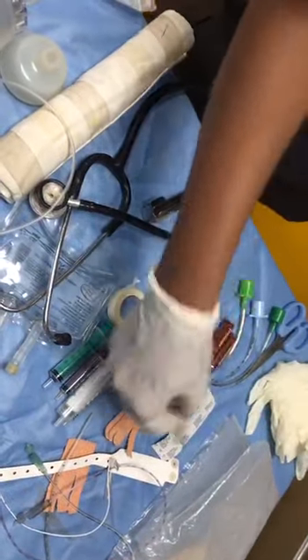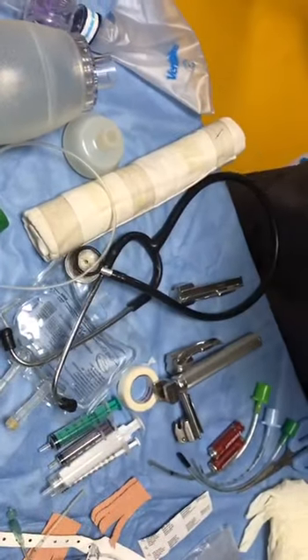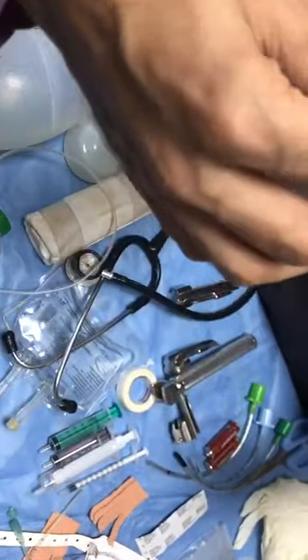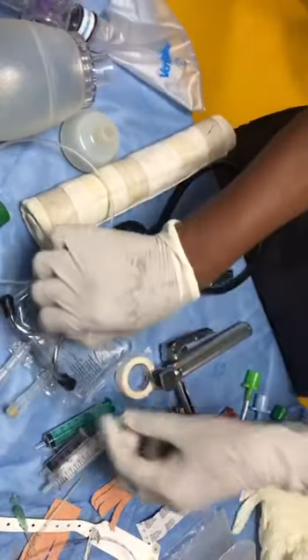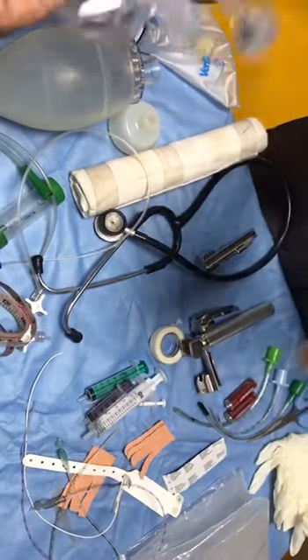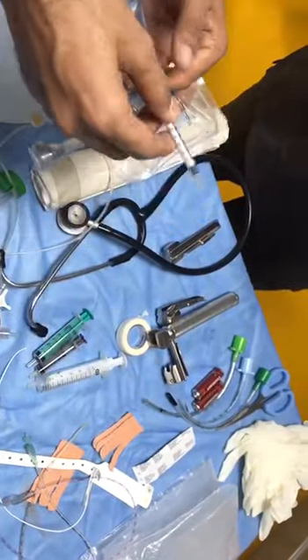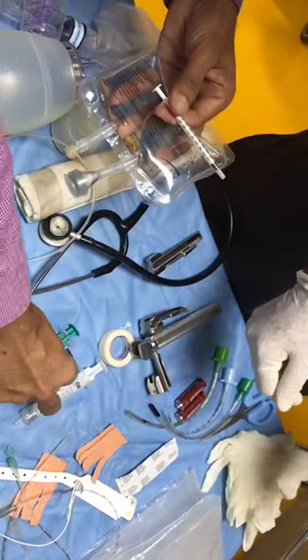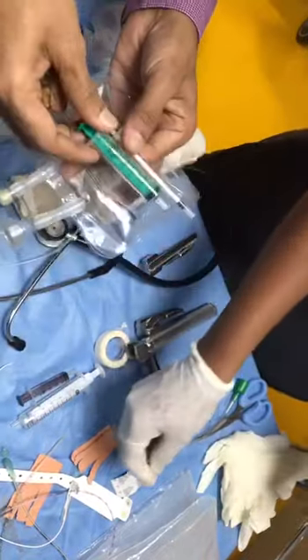And there is adrenaline syringe. Dr. Shafi sir, can you please take care of these things? Yes. And syringes are there. There is saline. Keep the stock solution. Adrenaline is there and normal saline is there. We keep it as 1 in 10,000 dilution, so that if at all we can use it. I'll keep it ready and I'll label the syringes. I'll take 0.3 ml per kg of 1 in 10,000 adrenaline for IV administration. And for ET administration, I'll take 0.9 ml per kg of 1 in 10,000 adrenaline and label the syringes.